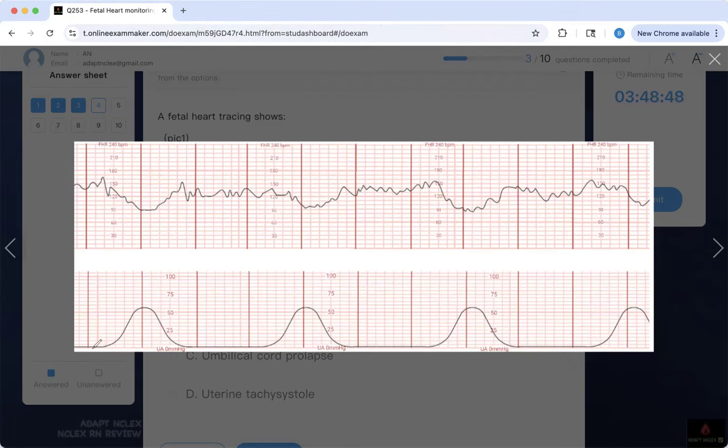So what you do, you draw your line. First, take the peak and then draw it to correspond to the baby's peak, right? You can see the baby's peak and mommy's peak correspond, right? Here and here and here correspond. When the baby's heart rate is all the way down, mommy is at the peak. Baby's heart rate is all the way down, mommy is at the peak.